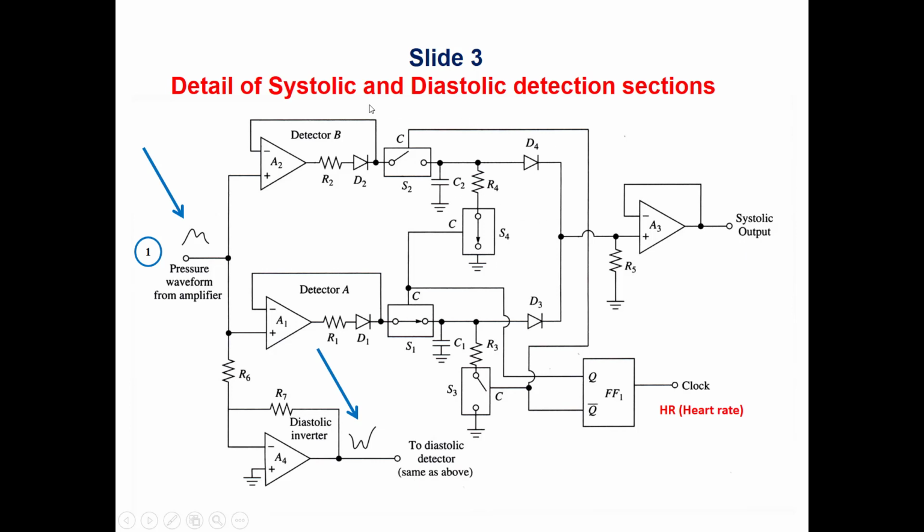So for this, we use two circuits, as we see here. Okay, one is used for the measurement, where the second will be used to discharge, as we see here, and will be prepared for the second beat. So in the first beat, the measurement will be made here, and this will be used only for discharge. In the second beat, this will be used for measurement, and this will be used for discharging of the capacitor to be prepared for the second reading.